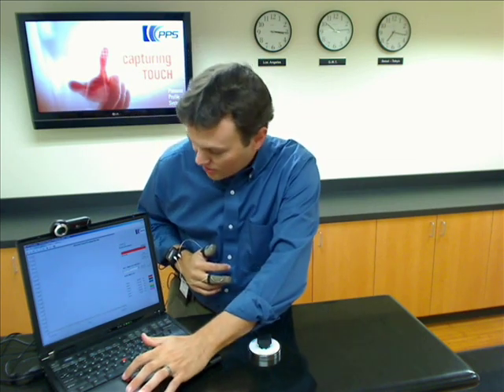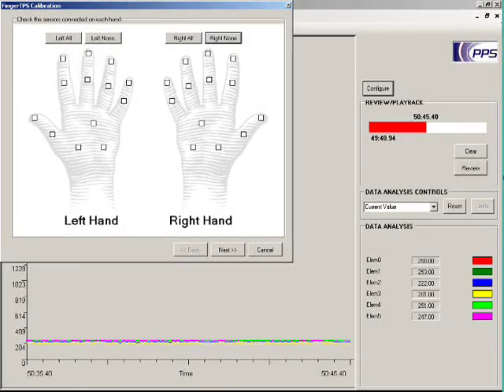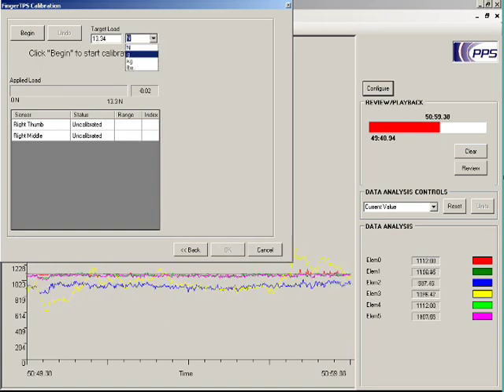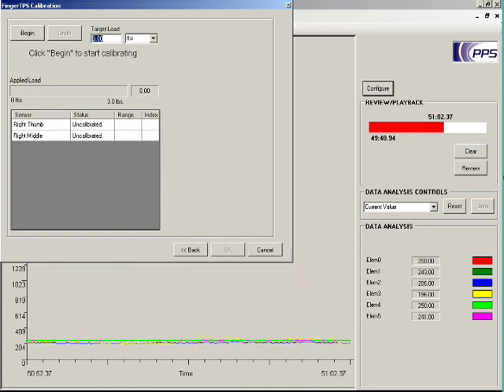First, in the software, I'll choose the fingertips calibration. In this first screen, I check boxes to indicate where I am wearing sensors — in this case, the middle finger and thumb of my right hand. On the next screen, I can choose the pressure units I will use. In this case, I will use pounds, and I will calibrate the sensors to five pounds.